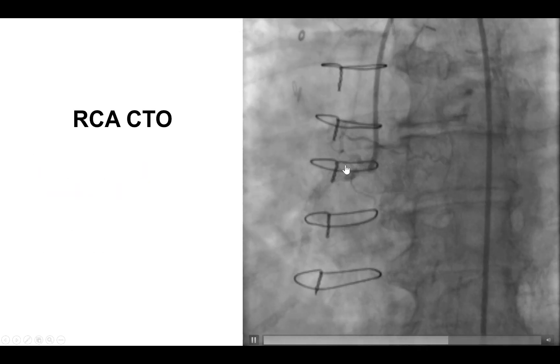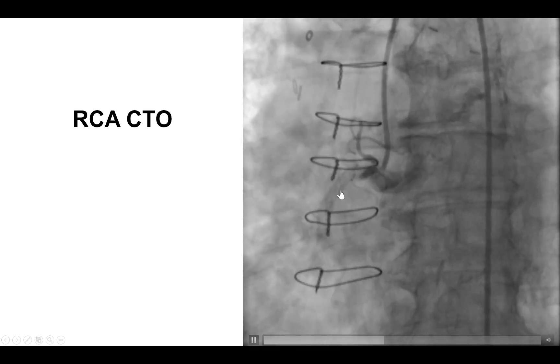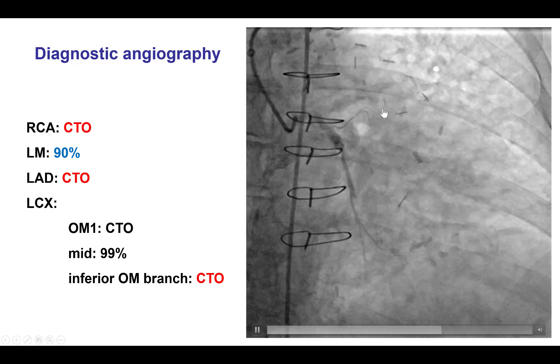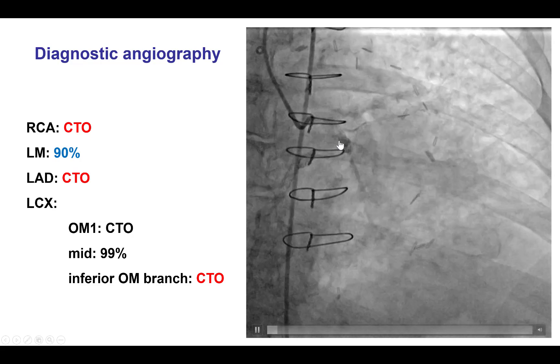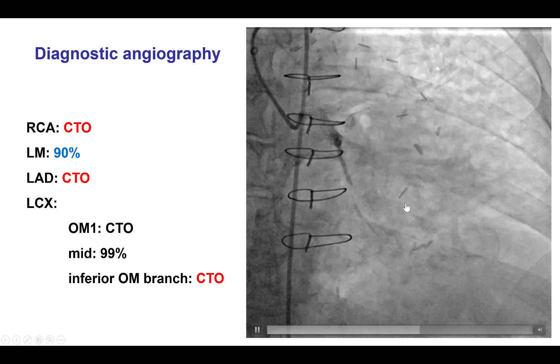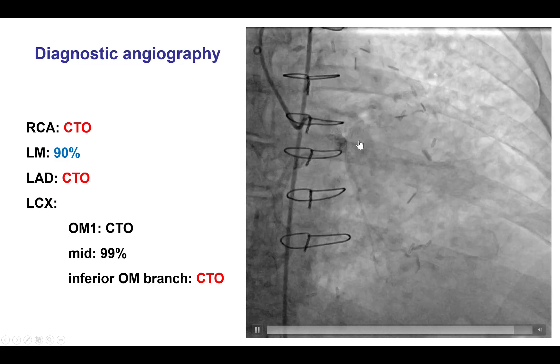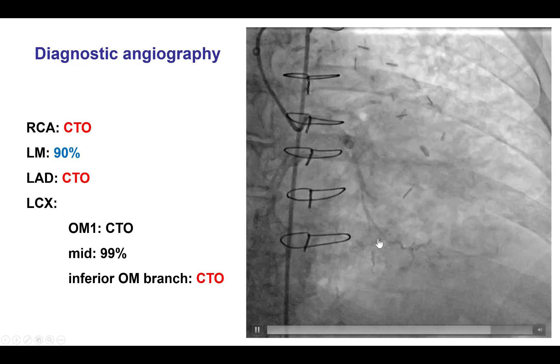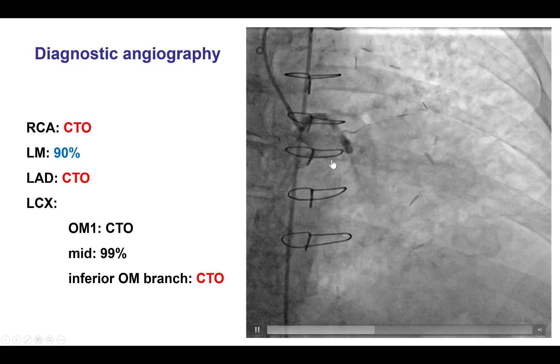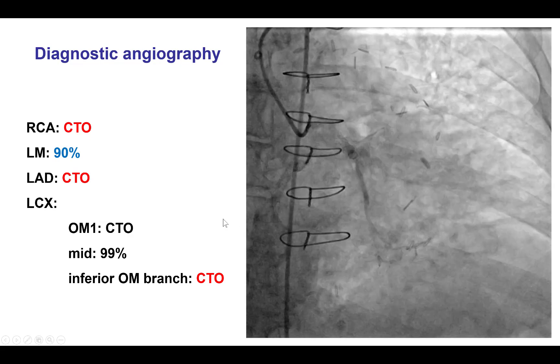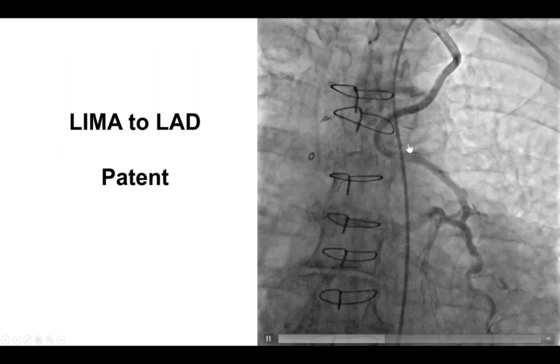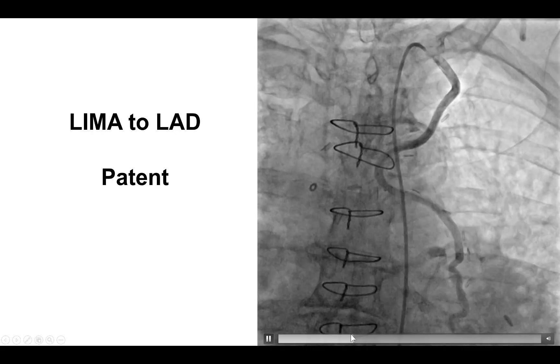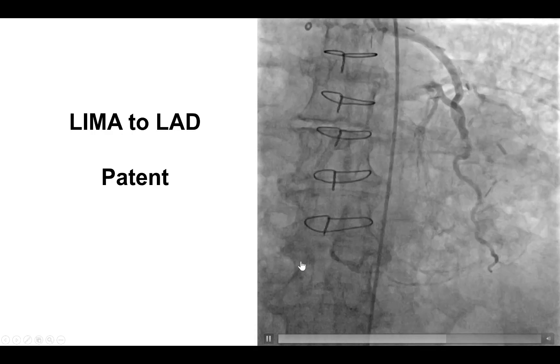She had a known CTO of the right coronary artery within previously placed stents. She also had an ostial occlusion of the LAD and severe disease in the circumflex with some competitive flow into the first obtuse marginal branch and TIMI 2 to 3 flow into the second obtuse marginal branch. When we look at the LIMA, there was good filling of the LAD, which was in turn giving collaterals to the PDA and the right coronary artery.